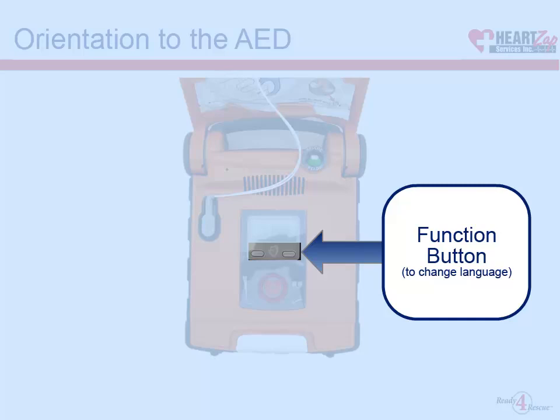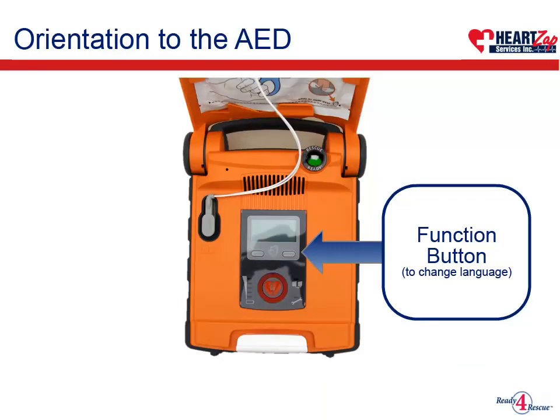The function buttons. The right function button can be pressed to change the language prompts from English to French and French to English at any time during an AED rescue. When you press the left and right function buttons together for 3 seconds, the AED will go into diagnostic mode.